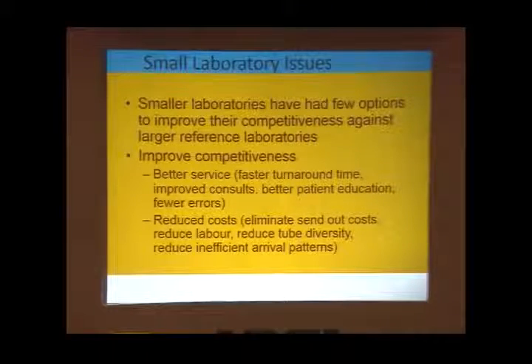But when you are running a small laboratory, you are always competing with larger laboratories, and they actually have a lot of opportunities and options to improve their laboratory service by faster turnaround time, improved consults, better patient education, fewer errors. And that will reduce their costs, eliminate send out costs, reduce labor. So actually, even if you automate your small laboratory or medium sized laboratory, it would help you to stand against the larger laboratories and pay back.